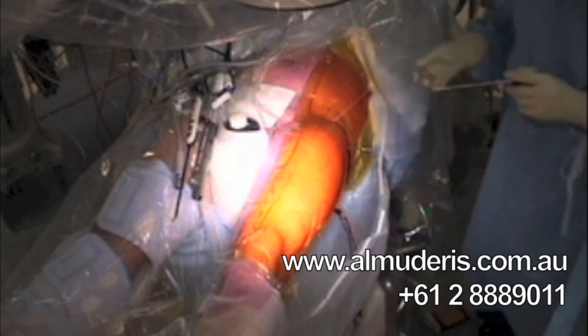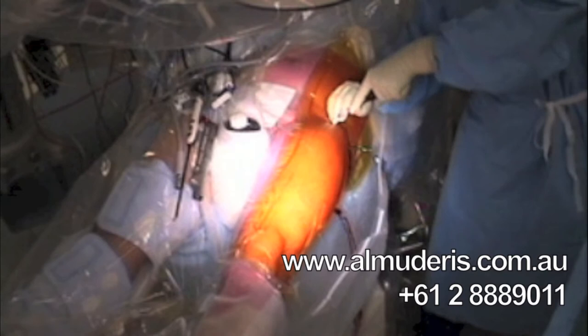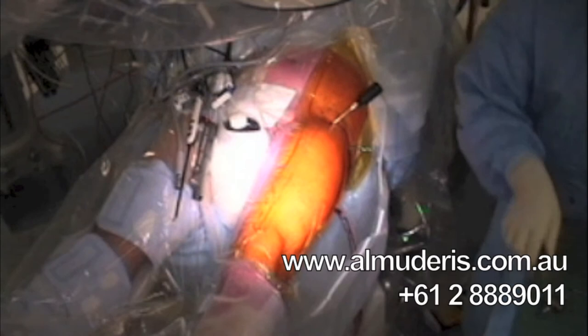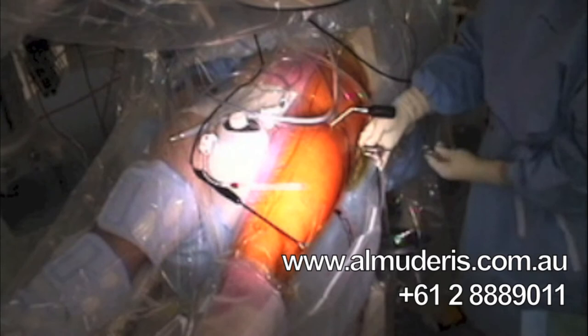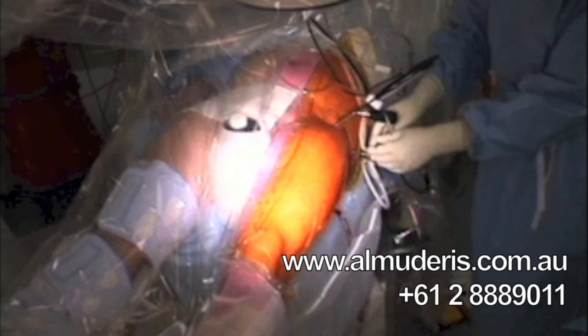Using the same trocar, I enter the front and I remove the guide wire. As you can see, the whole process so far is done without even looking inside the joint. Then I use a slotted cannula over that. I then proceed to insert the camera, and my assistant will be hooking up the suction and the camera. After insertion of all the instruments inside the joint, we proceed with the procedure.